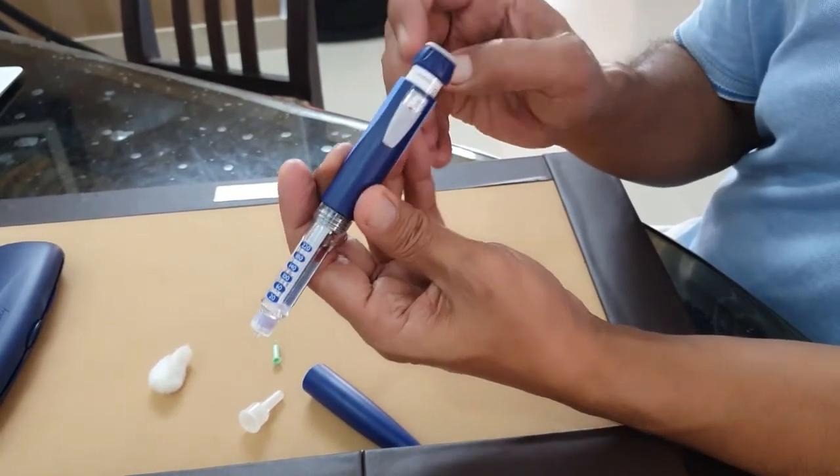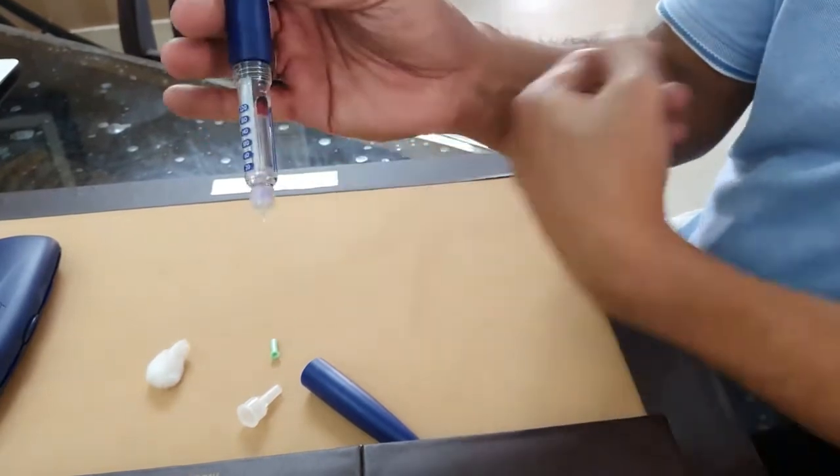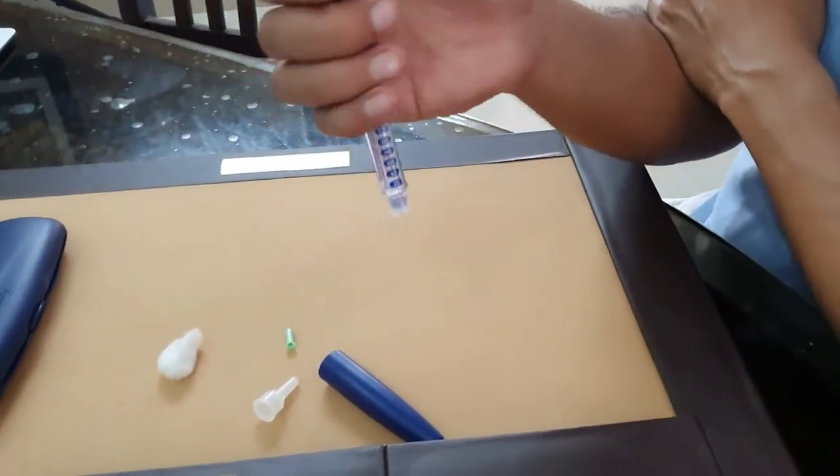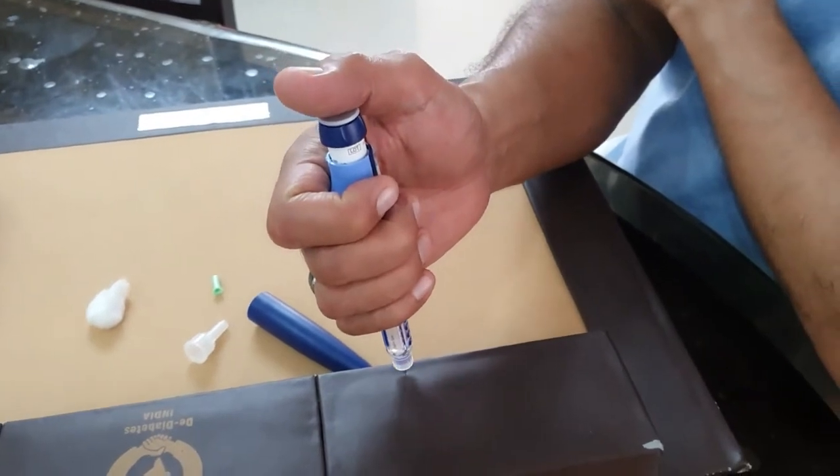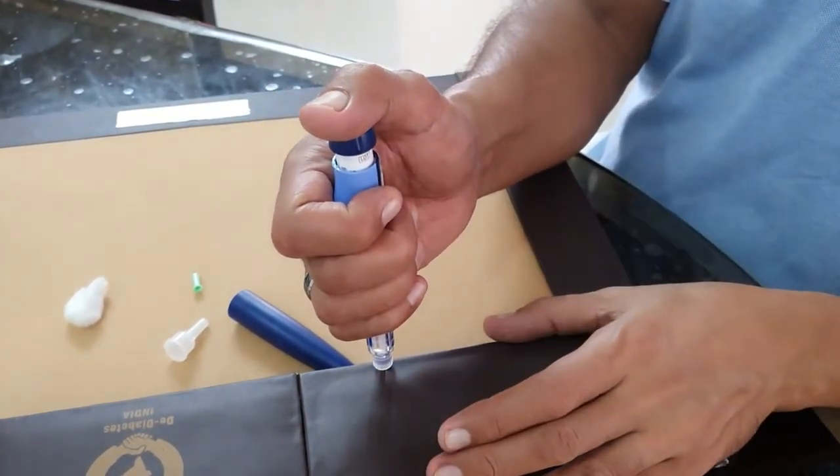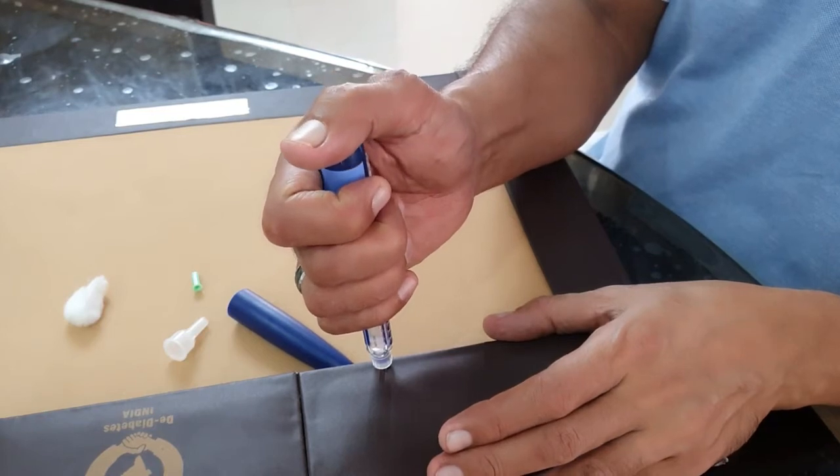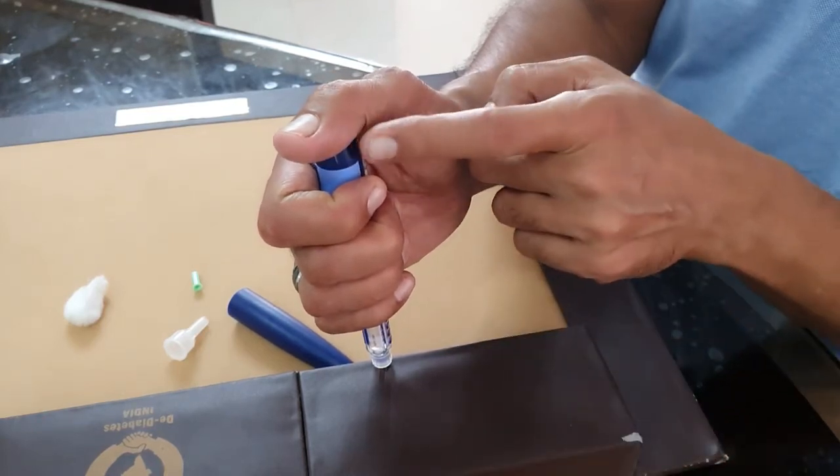Now you dial like this. If it is 15, you're going to keep it at the 15 mark. You're going to hold the pen like this and inject. When you inject, you're going to put it straight down on the body and inject like that.